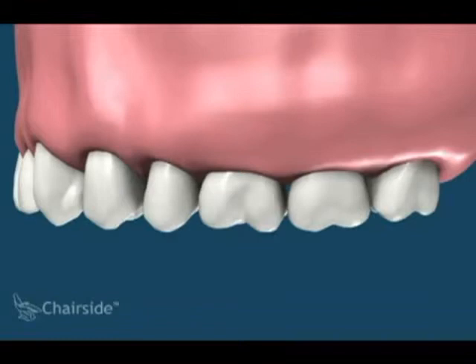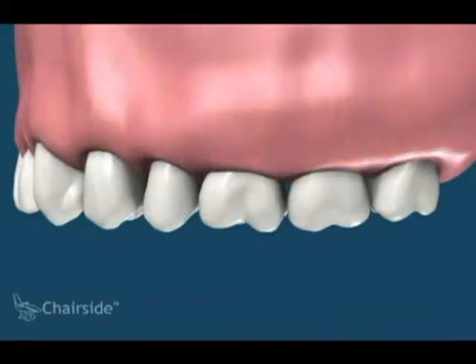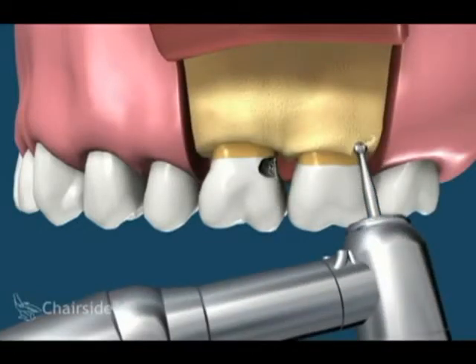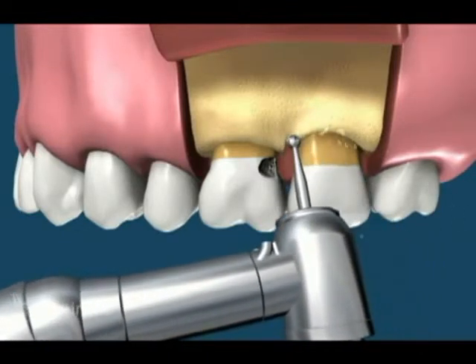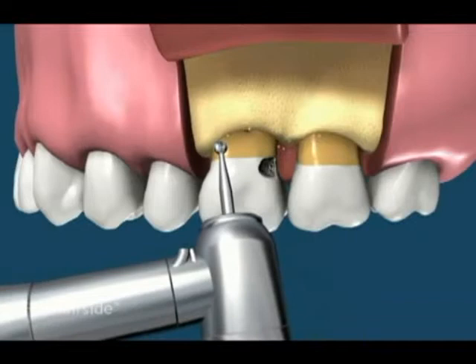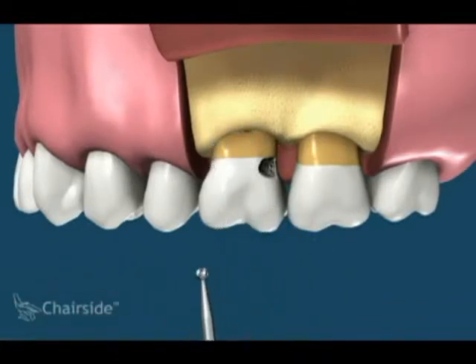A cavity may appear below the gum tissue and is often only revealed with X-rays. It is not possible to restore this cavity since the gums prevent access. A solution for this problem starts with the raising of a flap. Different instruments, including the dentist's drill, are used to reduce the bone height, and this new bone architecture is prepared to support the gums in a lower position on the root of the tooth. The new bone topography must follow all the previous peaks and valleys.